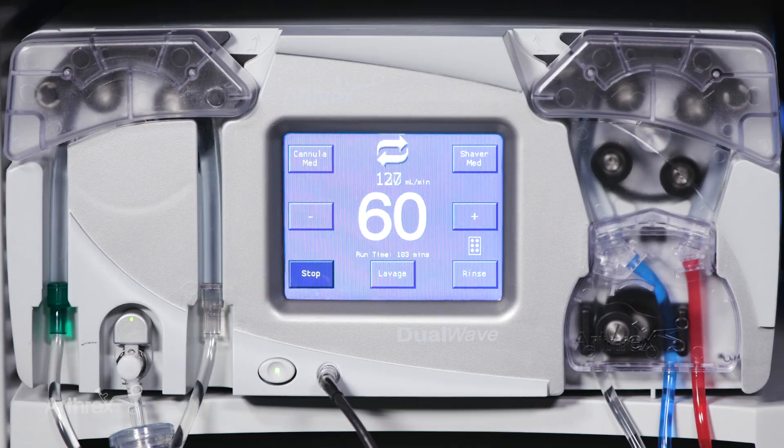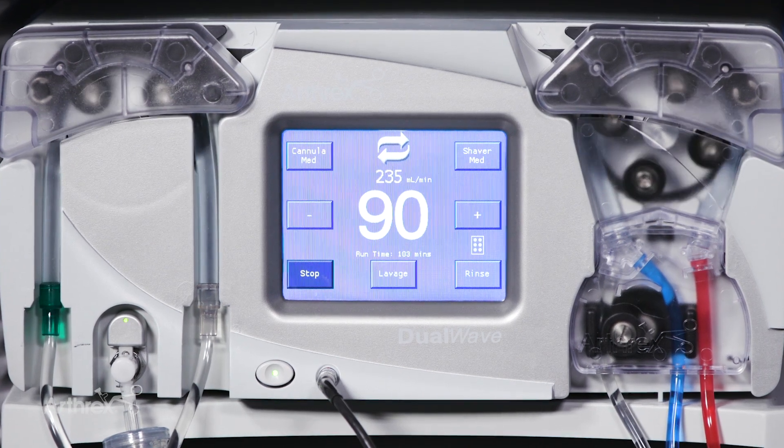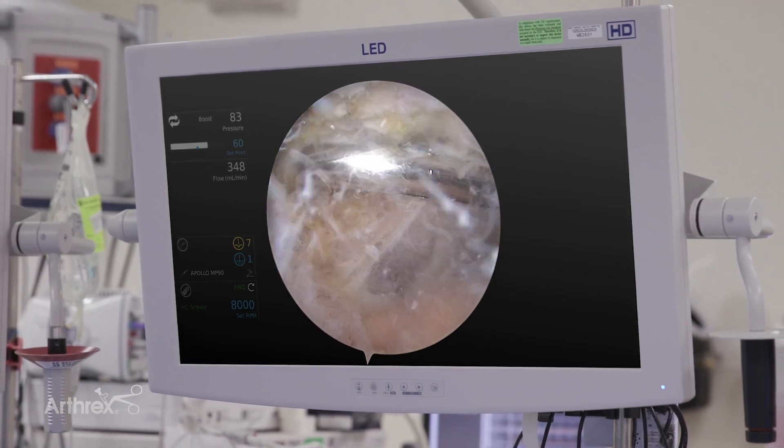It allows me to use different features like the lavage feature, where I get just a short time cycle of increased pressure, and also the rinse feature, which is just an increase in flow and allows me to clear debris and maintain a nice clear field.